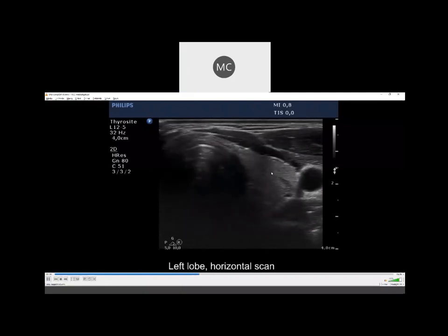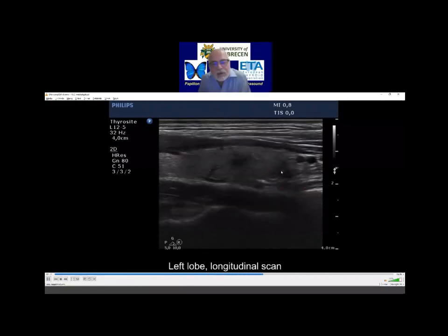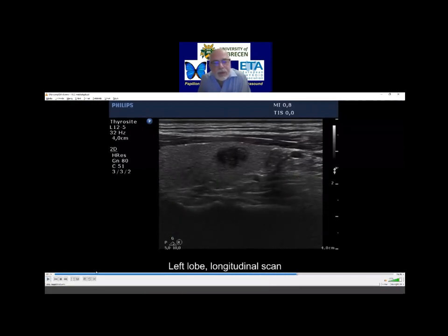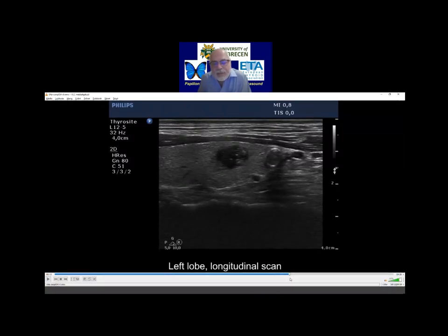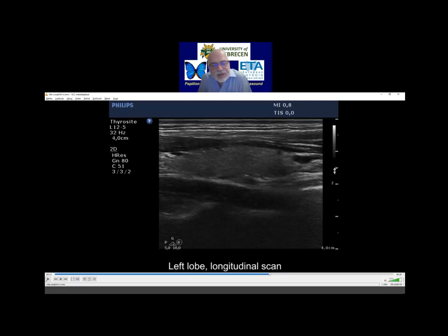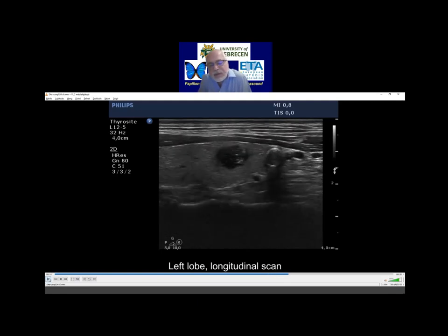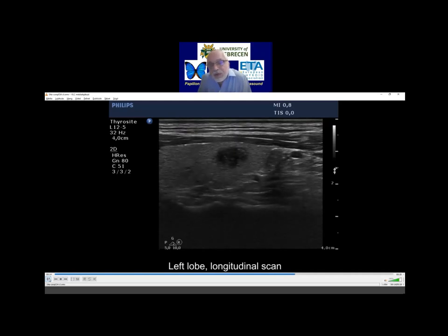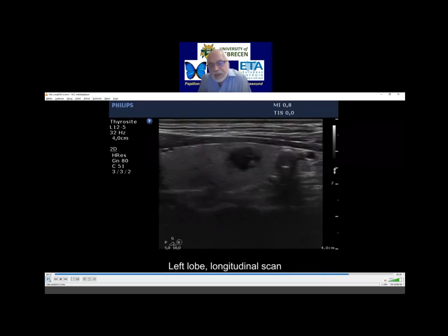We are speaking about this nodule. It is below one centimeter — you are absolutely right. It has a discontinuous coarse calcification. It had a capsule composed of coarse or macro-calcifications, and here this is discontinued. This is one of the possible suspicious signs of malignancy of a papillary cancer, not a frequent one. So I thought that therefore I should aspirate this nodule.